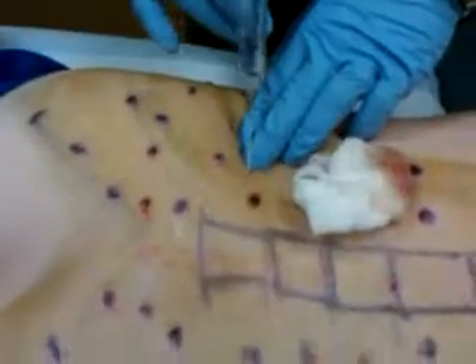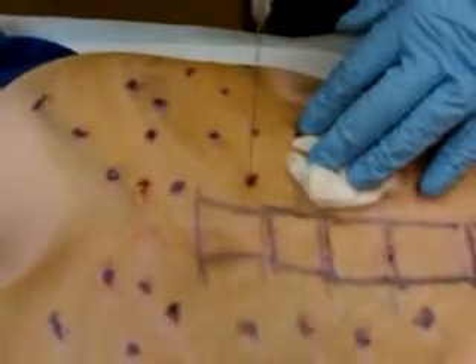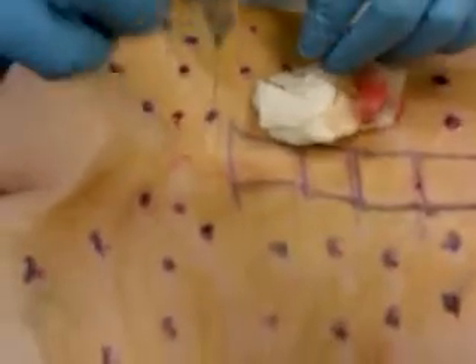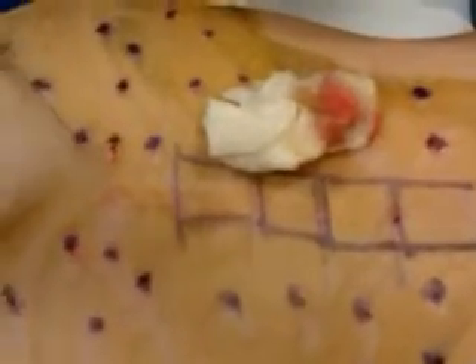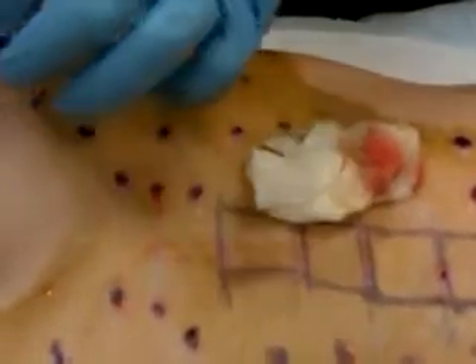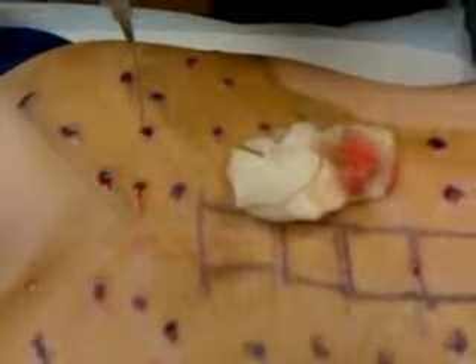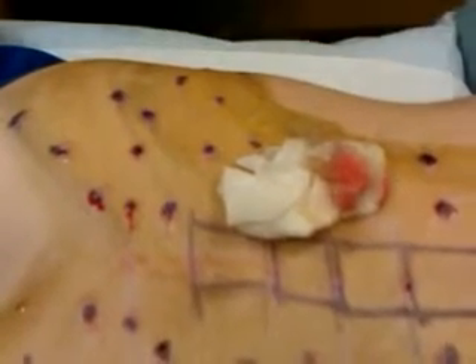I don't know if the weak of heart will make it this far in the video — probably 12 minutes. There we go with the 4-inch needle. It works very nicely. This needle does not discriminate — it cuts nice and easy. It's a sharp, fresh needle. It will pierce through the flesh nice and easy. The sharper the needle, the easier it is because it doesn't hurt as much. You want a sharp needle versus a dull needle. That's why I switch my needles in between. Laura doesn't have a lot of ligament tissue yet, so two needles is more than enough — but once you develop some ligaments, that will change.